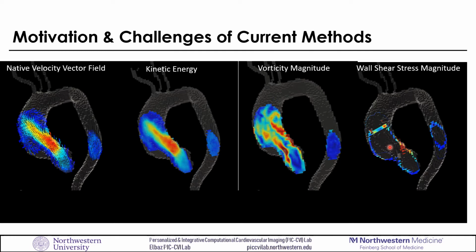Therefore, they might in fact be under-utilizing and under-assessing the severity of the disease, based on the under-assessment of the complex spectrum of flow changes in this case.